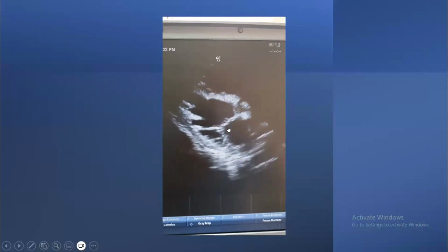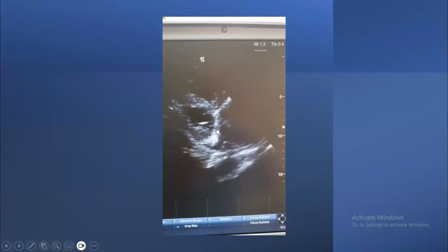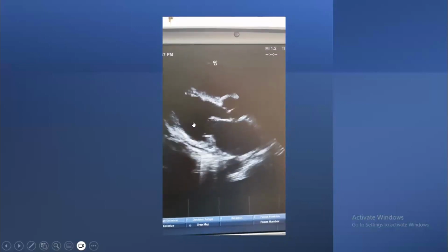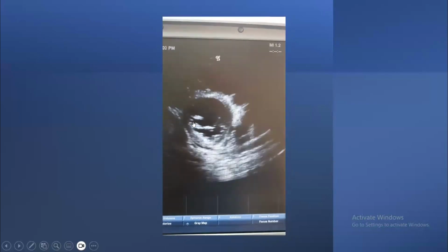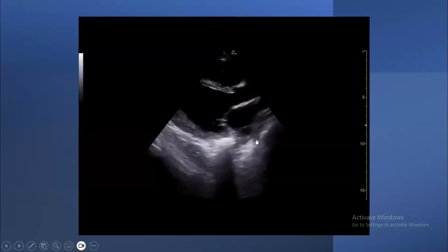And back again, you can see dilatation. The mitral valve is not touching, and there is dilatation. This is very poor contractility. This patient needs inotrope, not volume. It's dilated already. What about this patient?